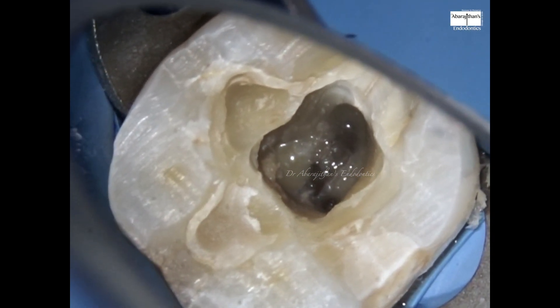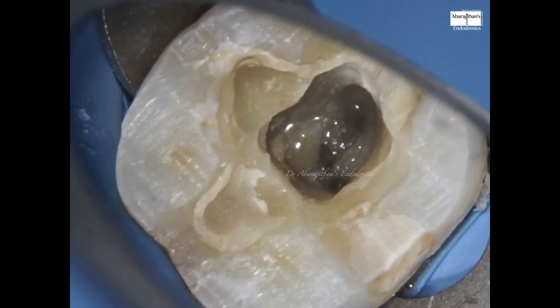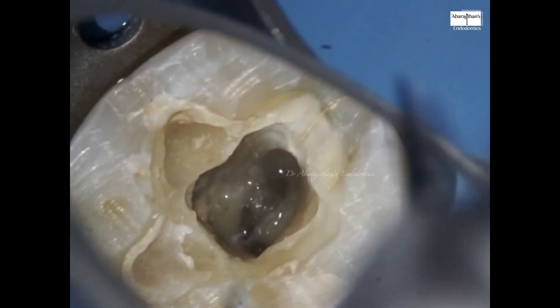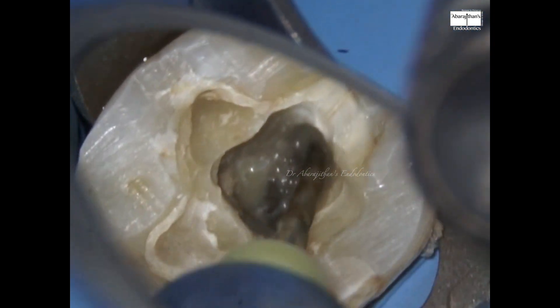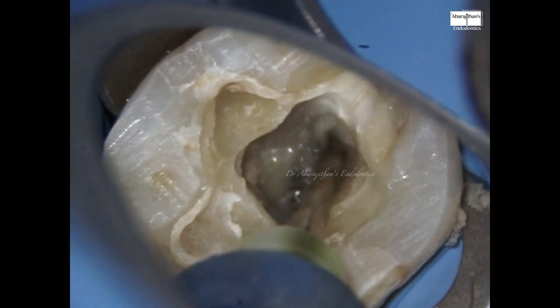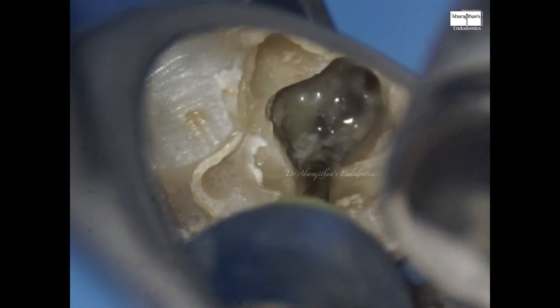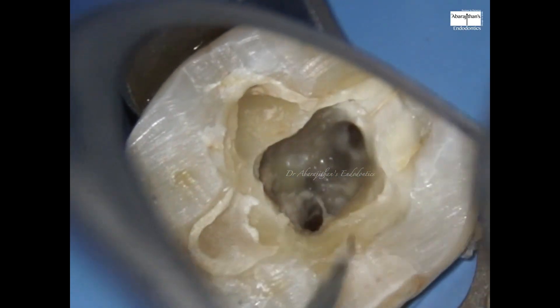We wipe the file to clear the flutes, then go to the next canal — the distal canal — not overdoing it, just brushing in the coronal third. After coronal enlargement we do ultrasonic irrigation.